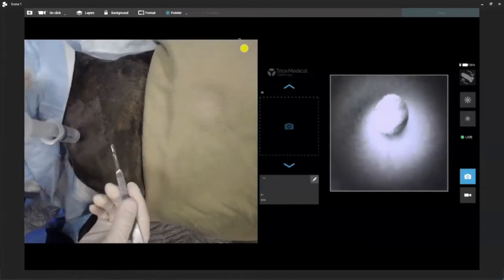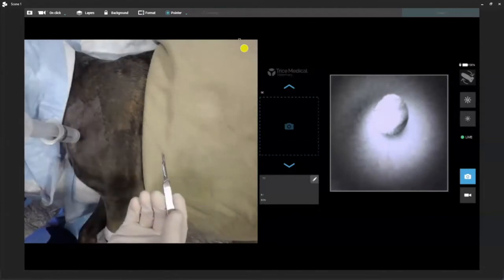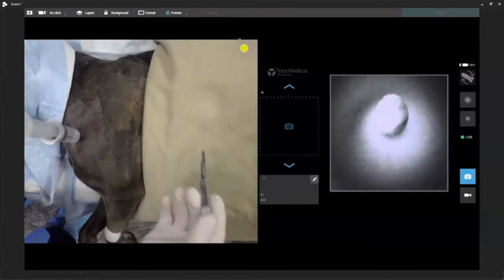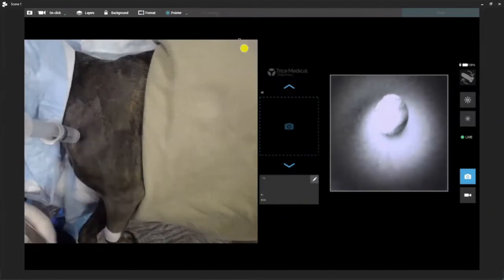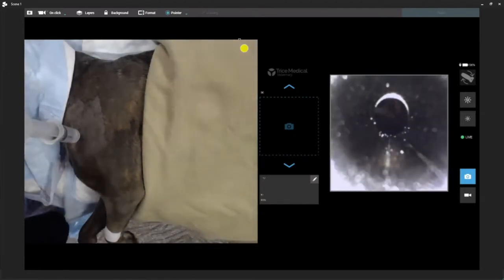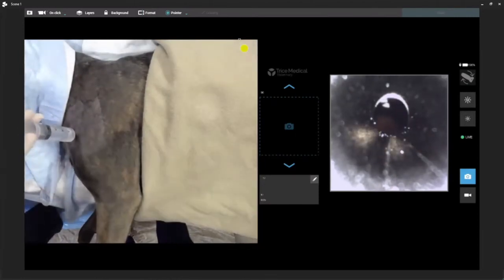If you use your blade — whether it's an 11 or 15 — to go into the joint, then you just lost your fluid. I'd rather use something blunt and slide into the joint, allowing the capsule to seal tightly around it so that we don't have a lot of fluid egress or soft tissue swelling. So now we're going to get our system going. The leg is just in a normal standing position.